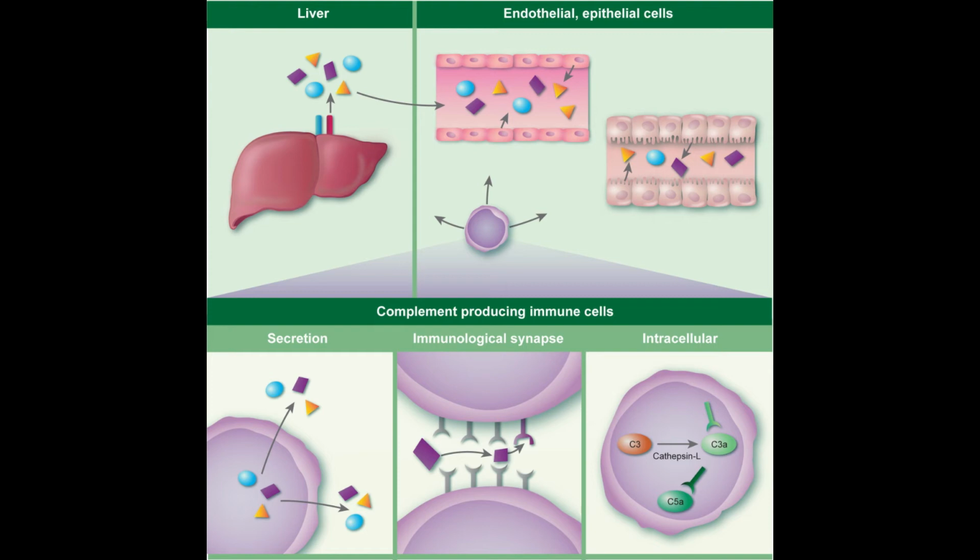After an additional incubation, the tubes are centrifuged and then read for hemolysis. If hemolysis is present, this means that no patient antibody was present and the test is negative. Lack of hemolysis is a positive test. Results are expressed as the highest dilution showing no hemolysis.